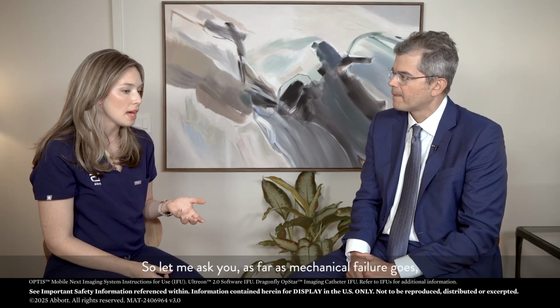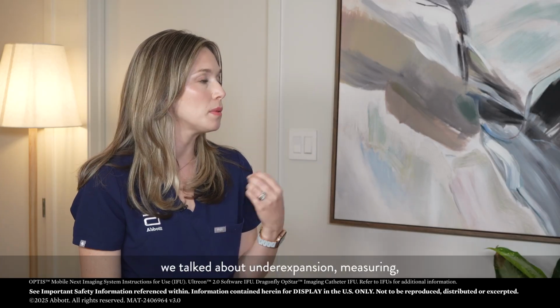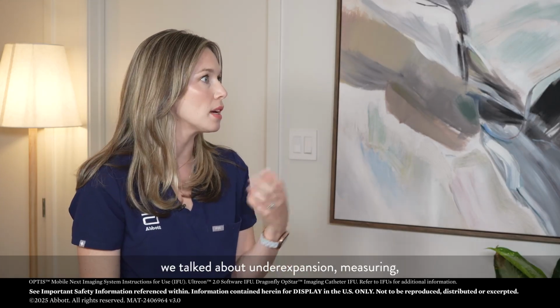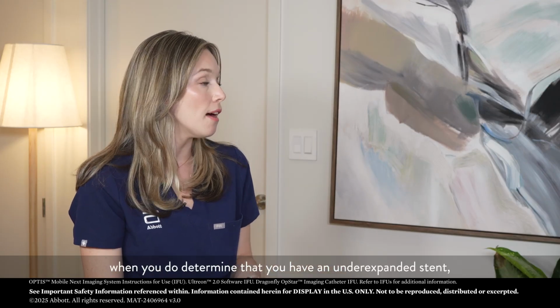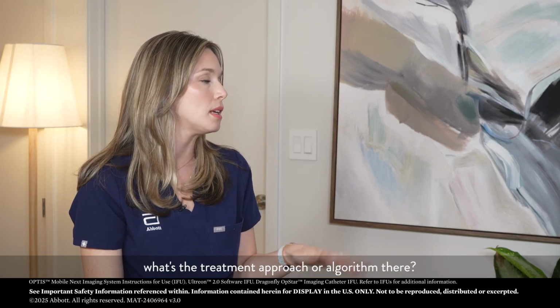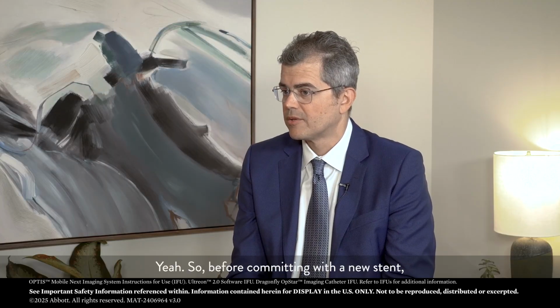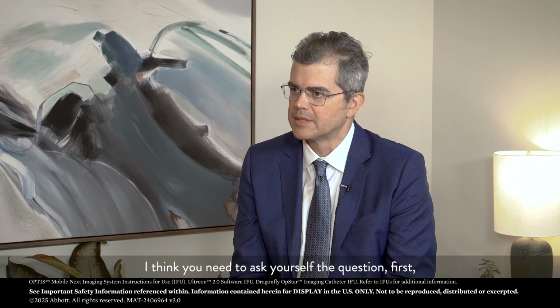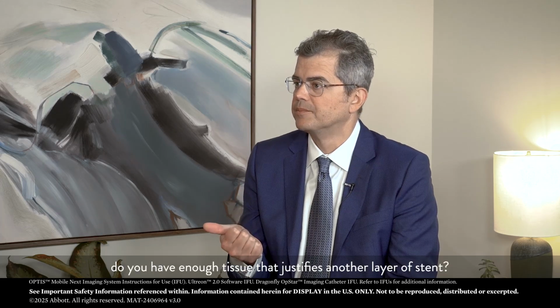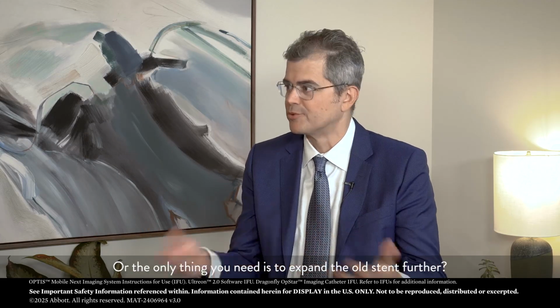And that makes sense. So let me ask you, as far as mechanical failure goes, we talked about underexpansion, measuring, and you have your reference there for free. When you do determine that you have an underexpanded stent, what's the treatment approach or algorithm there? Yeah, so before committing to a new stent, I think you need to ask yourself the question, first, do you have enough tissue that justifies another layer of stent? Or the only thing you need is to expand the old stent further, right?